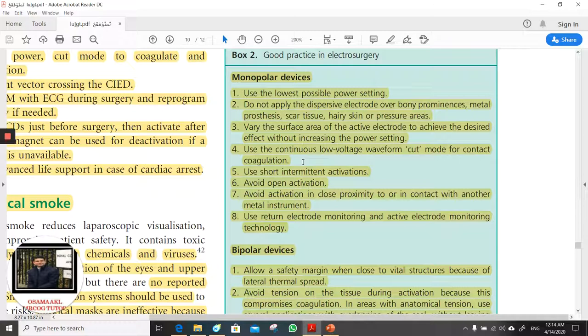You can do something else. You can do a mix. How? You will take the benefit of the low voltage of cutting, and at the same time apply it intermittently. So touch, don't touch. Touch, don't touch. So I made it intermittent myself. You will use the button of cutting, but intermittent, to give the effect of coagulation, which is a smart idea, actually. Intermittent activation.